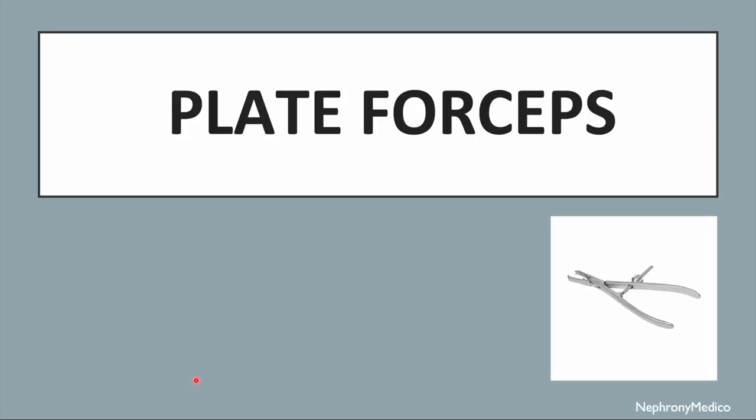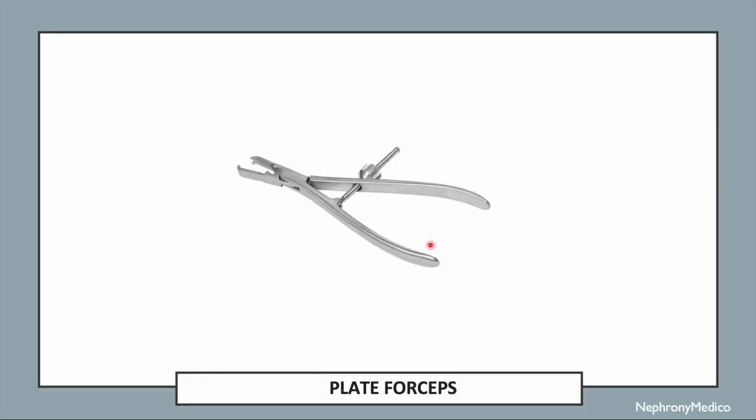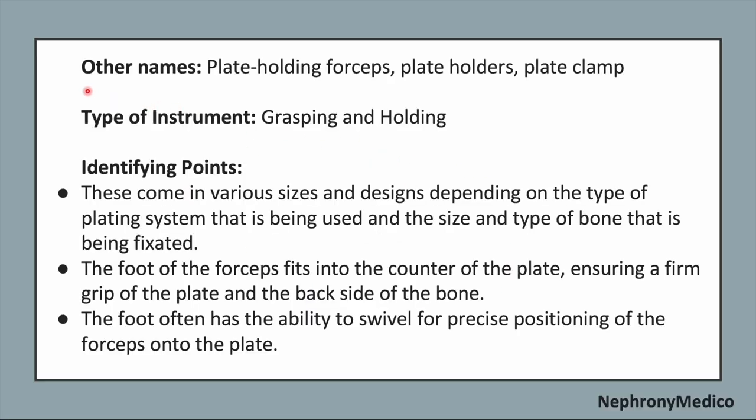Let's talk about plate forceps. This is a picture showing plate forceps. The other name of this instrument is plate holding forceps, plate holders or plate clamp. It is a grasping and holding type of instrument. Now, identifying points. These come in various sizes and designs depending on the type of the plating system that is being used and the size and type of the bone that is being fixated.